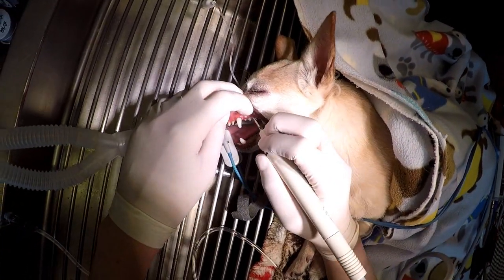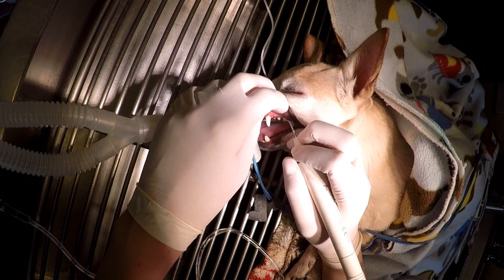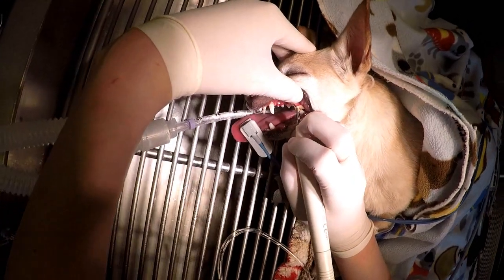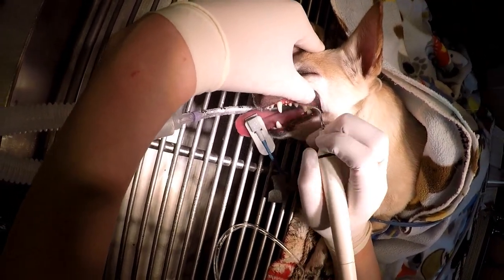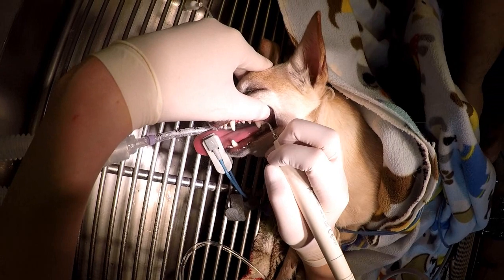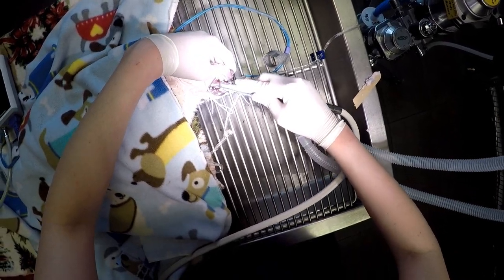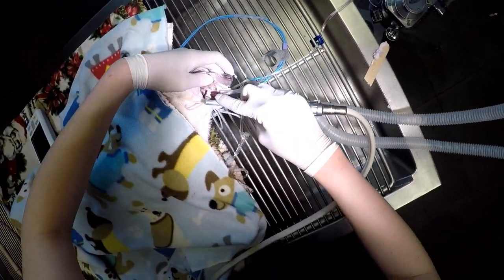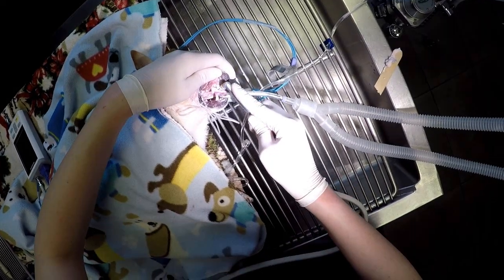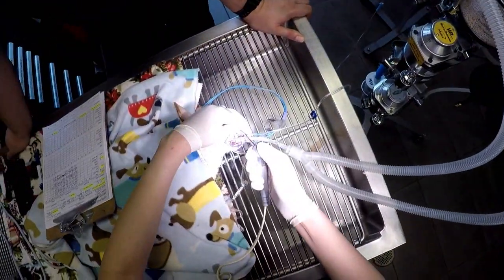Dr. Marcus probed all of her teeth and determined, thankfully, that no extractions were going to be needed. So I got to work and started scaling her teeth, making sure that every surface of each tooth was scaled, including underneath her gum line. After I was done scaling, I went in and applied a profi paste to each tooth. After I was done brushing her teeth, I went back in and rinsed out her mouth completely.